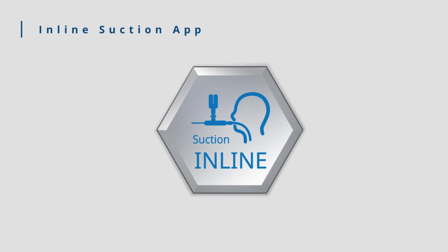This video will cover the Inline Suction App of the Nihon Kohden ventilator. It is only available with NKV550 and NKV440 ventilators.